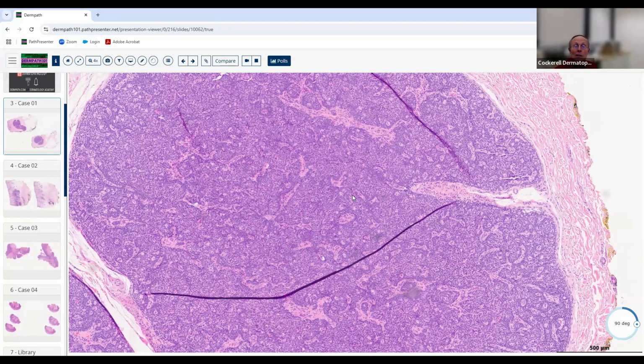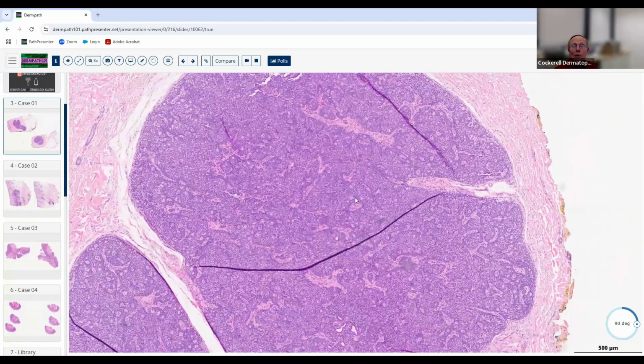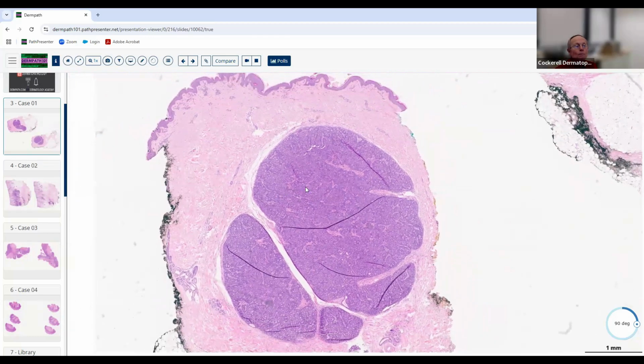So the lymphocytes here aren't coming in to try to wipe out the tumor. It's thought that they're actually part and parcel of this entity, which may be somewhat analogous to what happens in the thymus gland, where there's epithelium, but there are also T cells there.